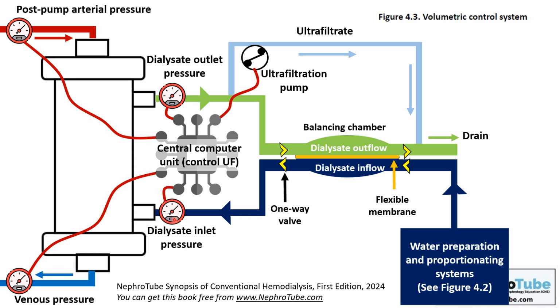Usually, it is adjusted at 500 ml per minute. But is there any benefit from increasing the dialysate flow rate from 500 to 600, 700, or 800? And does this affect the adequacy of dialysis? This is what we will talk about in detail in chapter 6, inshallah.